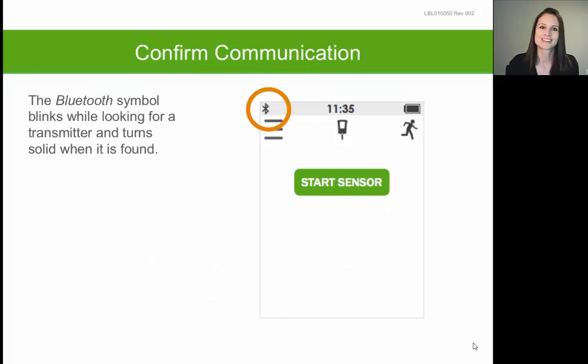Once you've set your high and low alerts, it will bring you to the receiver home screen where you will see a start sensor option. At this point in the receiver setup, do not tap start sensor — you must first insert a sensor and transmitter onto your skin before selecting start sensor.